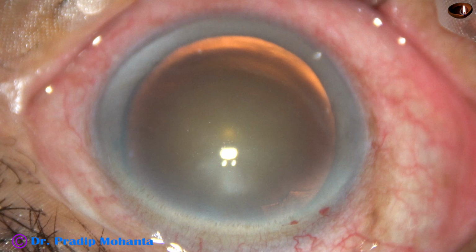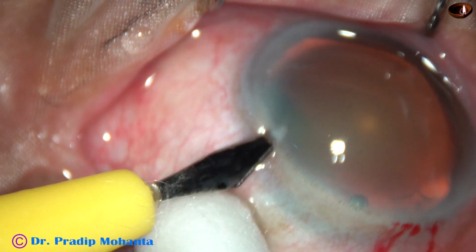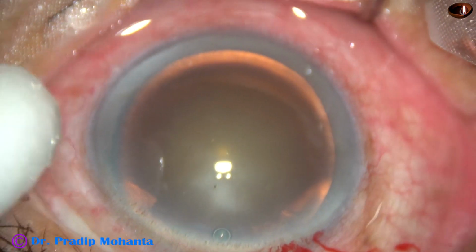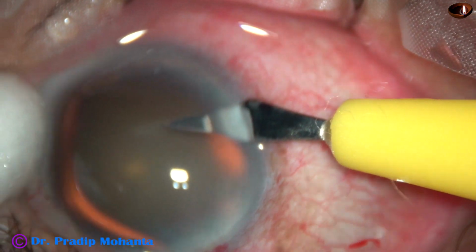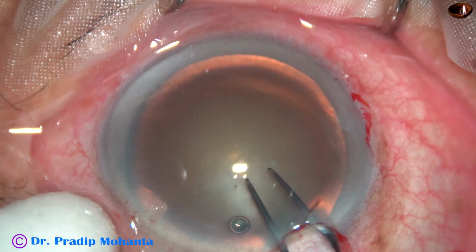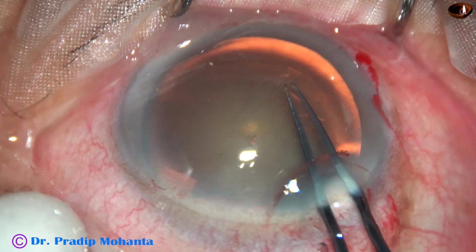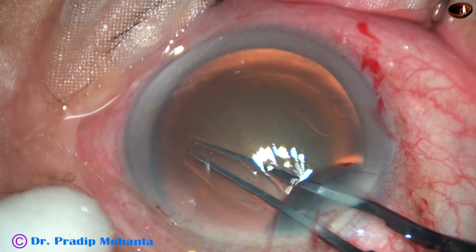Now let us see this case. Another case with grade 3 nuclear sclerosis. This is the customized lens tip I use, 1.6 millimeter, so that the Simcoe can go into the anterior chamber. And now, for the capsulorhexis, I prefer to do the rhexis with Utrata.